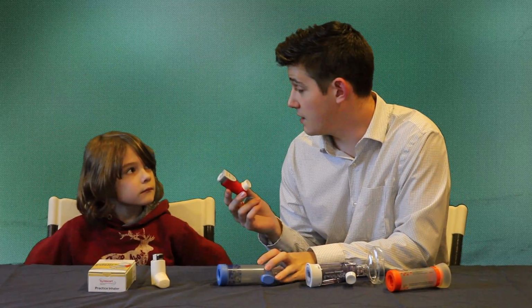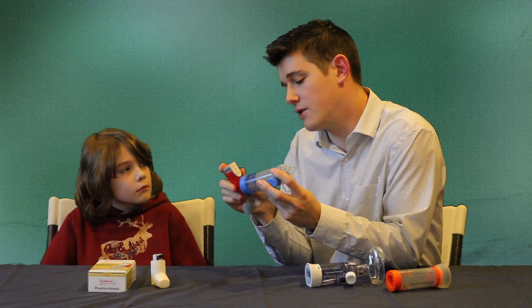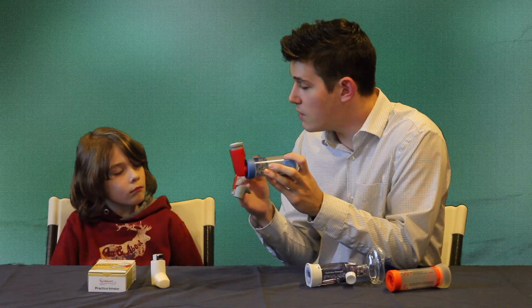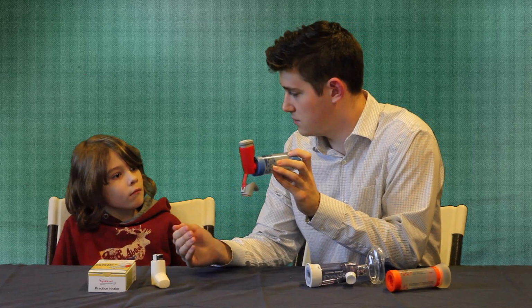Now that your inhaler is shaken up, you're ready to connect it to the spacer. The spacer is this clear tube that holds the medicine inside before you breathe it in. And this part is kind of tricky. Before you even put the spacer in your mouth, you have to breathe out all the way.